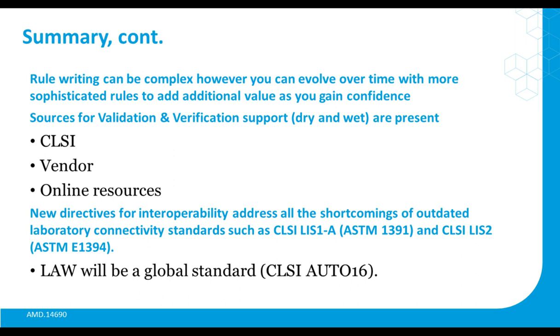Like I said, the sources for V&V support, both the dry test and the wet test that you'll need to conduct, are available from the CLSI, from vendors, and there's a host of other online resources out there. New directives for interoperability, getting us away from the old serial standards and into HL7, are all available, and the advent of them is out there online.